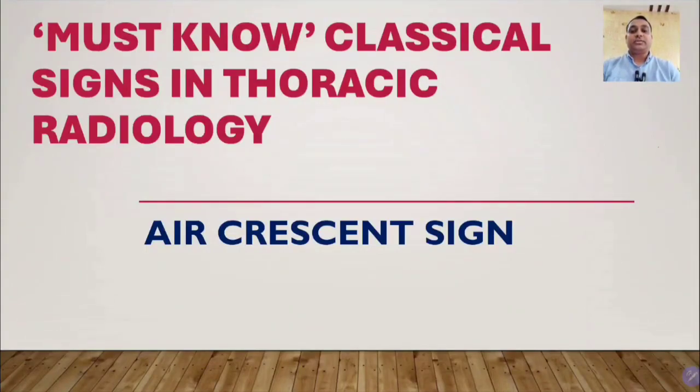From today onwards, I am going to start a very short lecture series on must-know classical signs in thoracic radiology, so that you will be able to identify the important thoracic radiological signs which help in diagnosis.